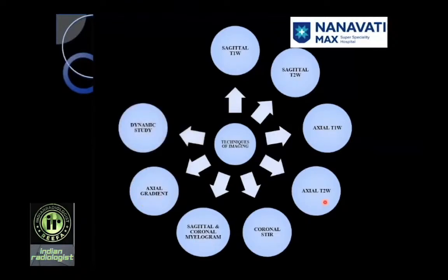A lot of people who have undergone wide laminectomies suffer from post-operative listhesis, which is best seen in flexion and extension studies. So a fast T2 sequence in flexion and extension in addition to the neutral position is also useful in the post-operative spine. At the atlantoaxial junction, when you are looking for atlantoaxial instability or subluxations, a flexion extension in dynamic mode is a necessity. Again, the slice thickness there is 3 to 4 mm.